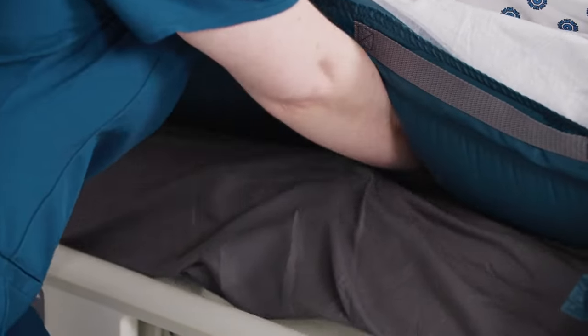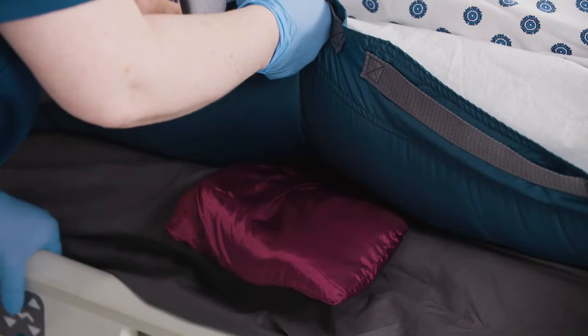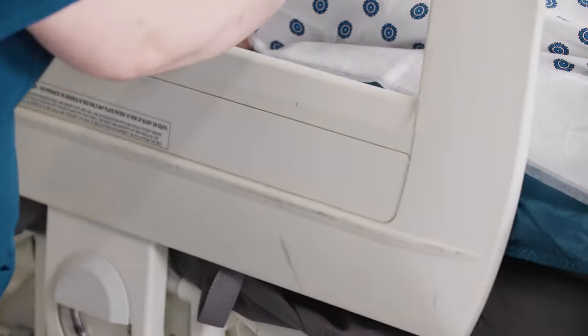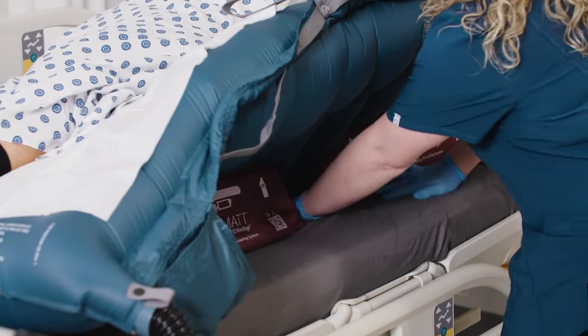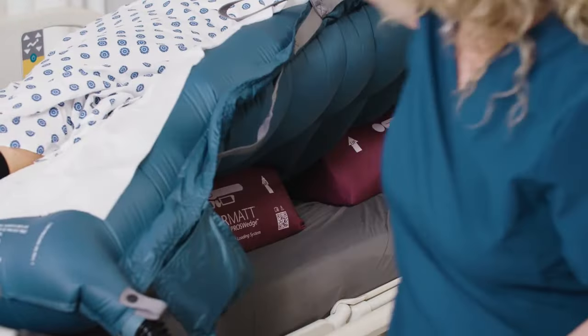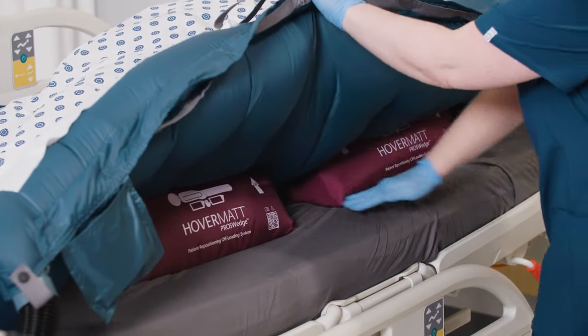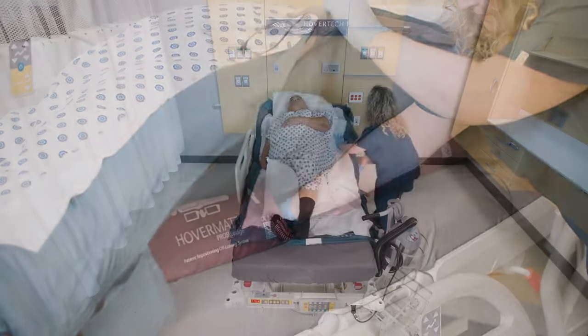Pull the tail through to the other side of the patient to anchor the wedge. After the wedges are placed, make sure the sacrum is not touching the bed — it should be floating. If it is touching, reposition the wedges to ensure sacral offloading. Deflate the mat and reconfirm the placement of the wedges. Raise the head end of the bed and side rails or follow your facility's protocol.